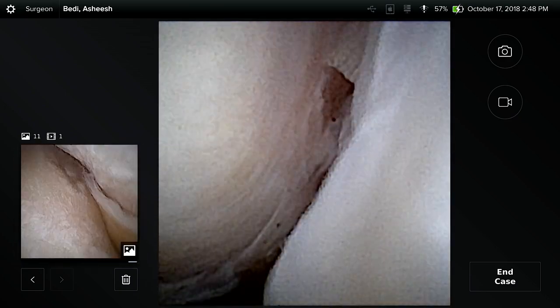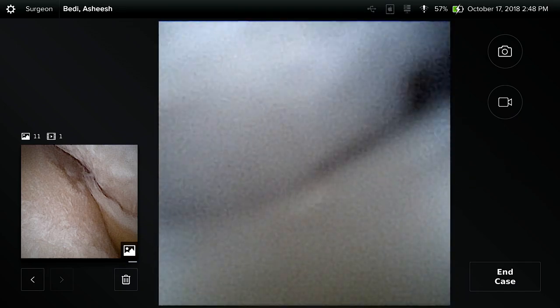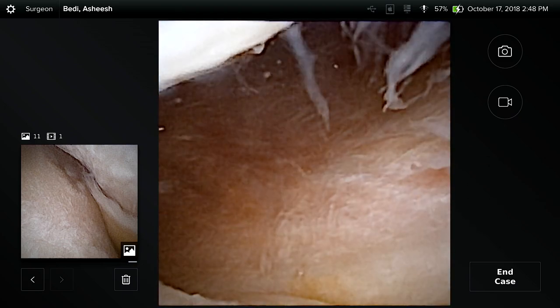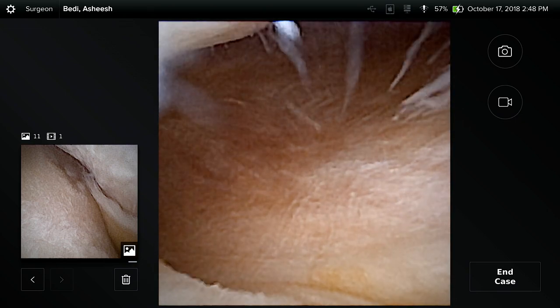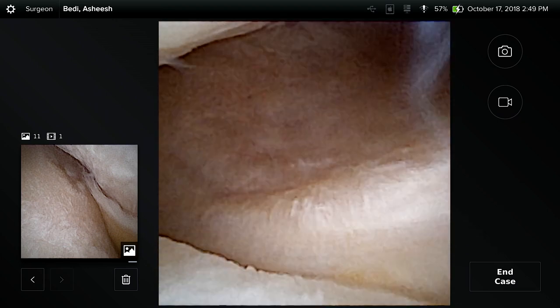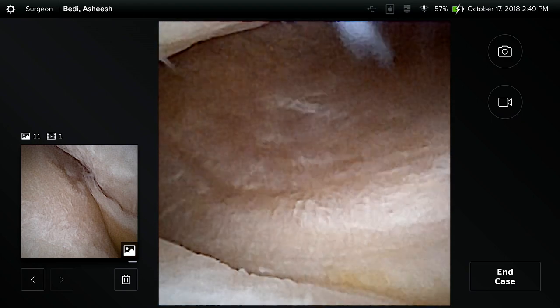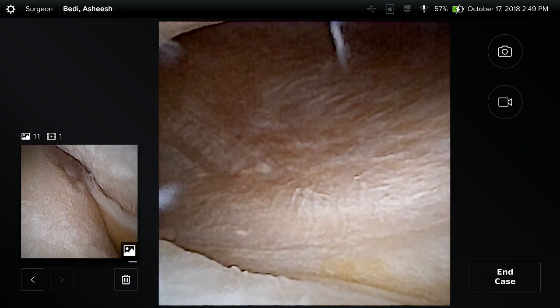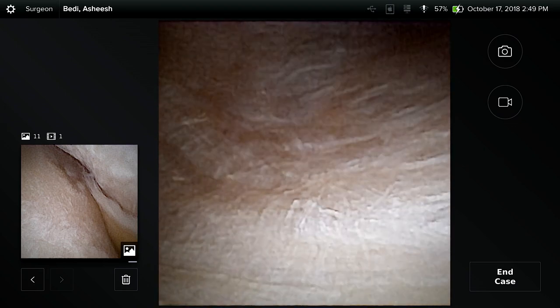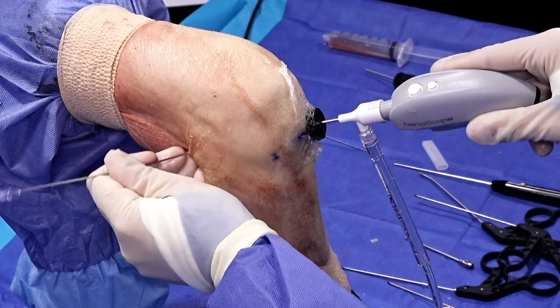Looking here now — there's our lateral compartment, there's our ACL ligament fibers. We can drive just deep to the ACL and into the back of the knee — that's our posterolateral recess, atraumatically accessed without difficulty. Sometimes we want posterolateral portals to instrument ramp lesions or have an indwelling camera for a unique view of a lateral root. I'll take a spinal needle and show how atraumatically we can access those locations under direct vision with the knee hanging in a neutral position.